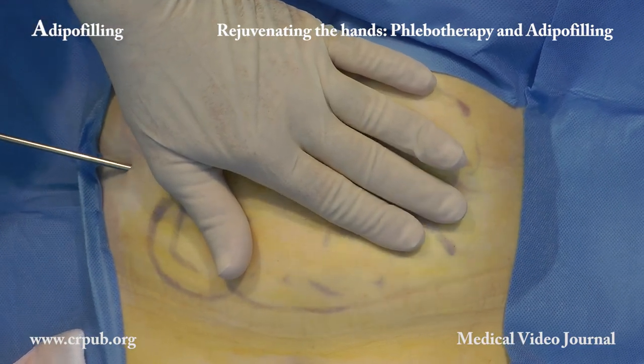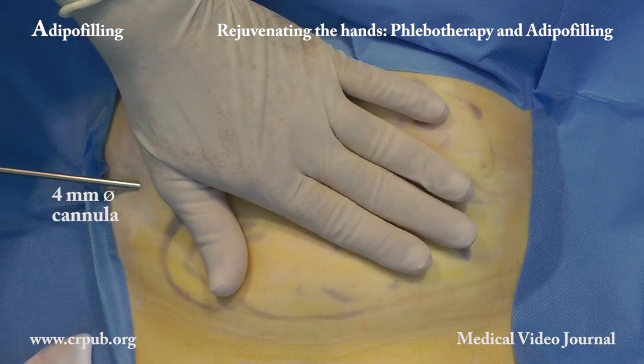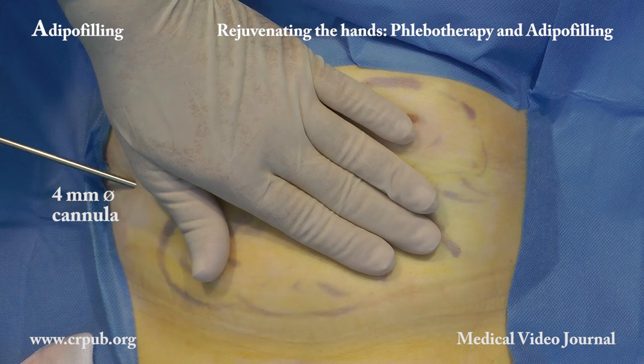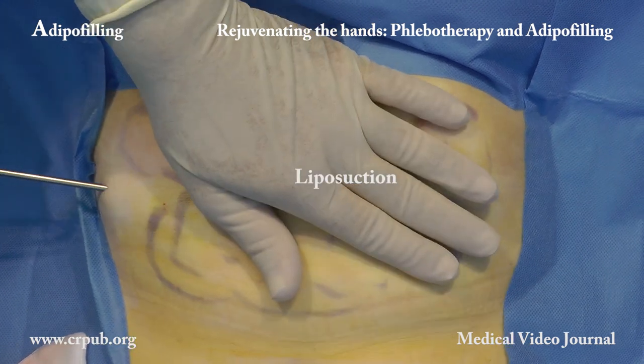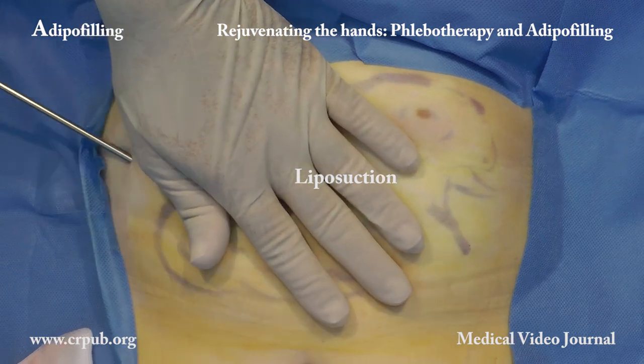Liposuction is carried out by means of a 60ml syringe, a catheter, and a 4mm diameter cannula. We normally aspirate a larger amount of fat than that which is to be injected.